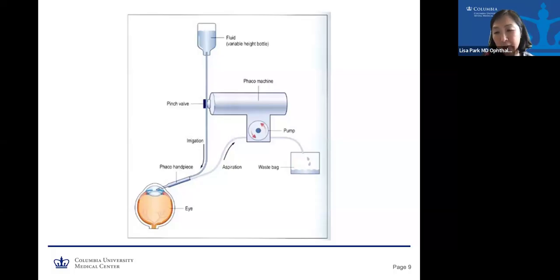And this is what makes the challenge of trying to do this successfully. One of the difficulties that we have is that the phaco machines that we're using in the developing world often come with disposable components. And so that is expensive and inefficient, although it can allow for us to have better fluidics. And so the machines we are generally using when we come to operate in Ethiopia and Tanzania are machines, not that they're old, but they're machines that are more sturdy because they have reusable parts. And so the fluidics are going to be slightly different. And that is why the technique by which we have to do this has to be modified.